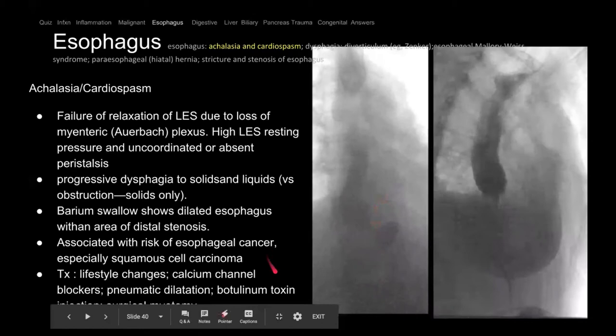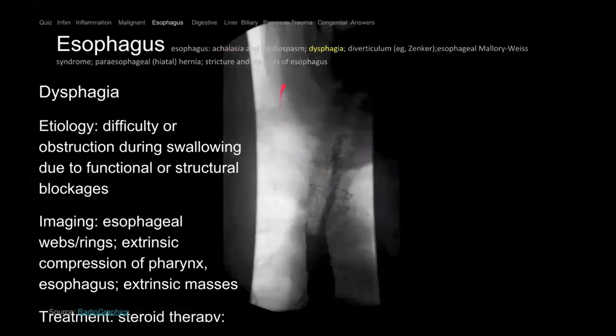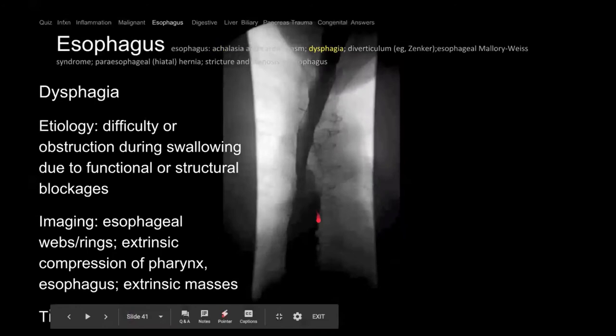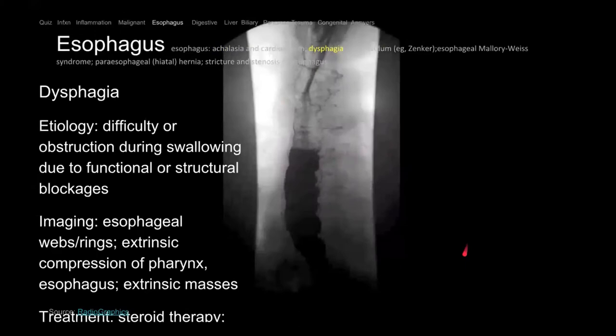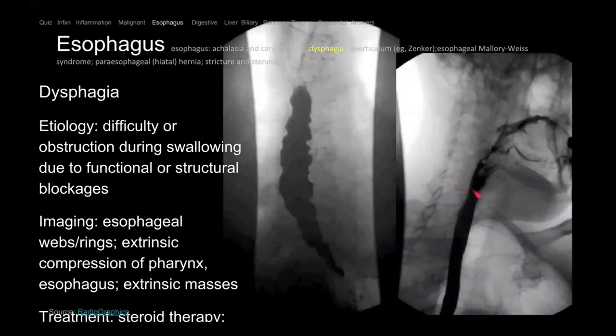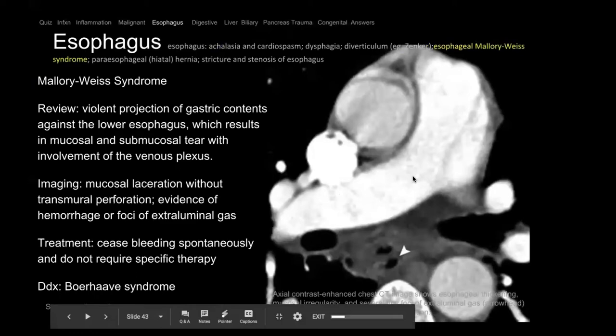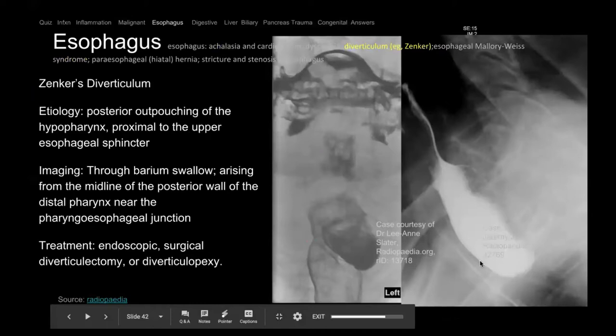In contrast to achalasia, here we have tertiary contractions — dysmotility. The contractions are abnormal and non-propulsive, which can cause dysphagia. In contrast, here is a web — a cervical web — the patient drinks and there's a little waist that's pinched. A large solid bolus can get stuck there. This is called a Zenker's diverticulum — there's an outpouching seen posteriorly. The esophagus is here and the outpouching is here. Patients can have food get stuck there, severe halitosis, and it can be resected.